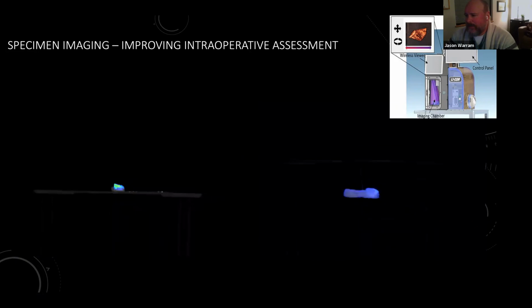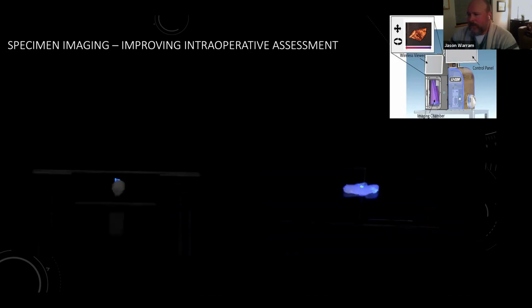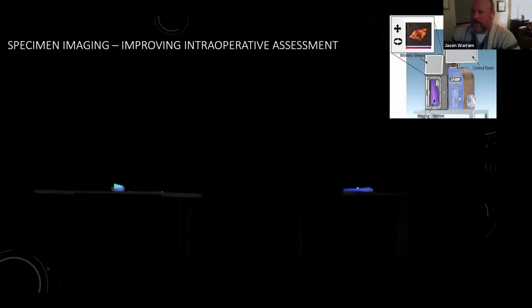This is an example of a prototype device that was developed by LICOR, where semi-tomographic images could be taken. And you can imagine if the surgeon has resected a couple of margins that are now headed to the Frozen's lab, these margins can be imaged, and this video can accompany the margin to the pathologist to help highlight and localize specific areas of that tissue that the pathologist wants to sample. Again, this is to reduce sampling error. And then in the histological world, the presence of the fluorescence where the disease is contained also helps with discordance when two pathologists don't agree on whether or not there's tumor localized on the slide.